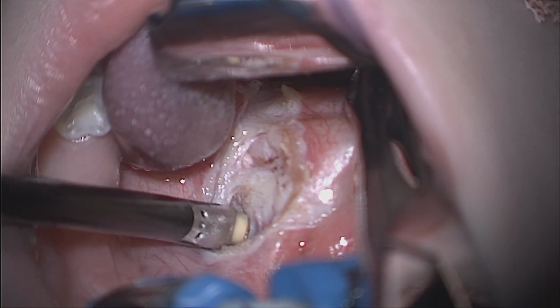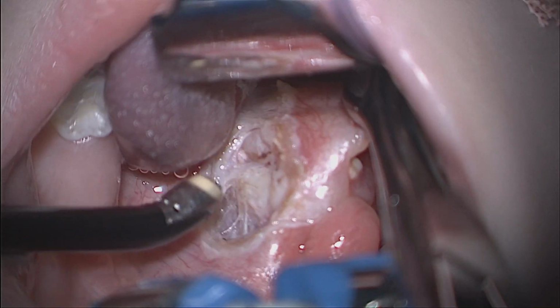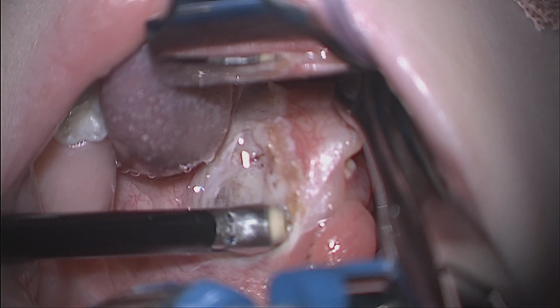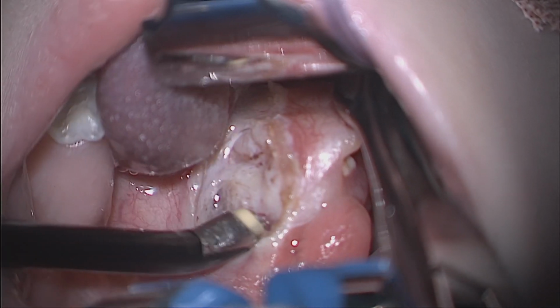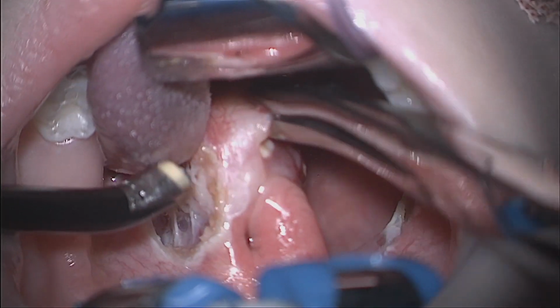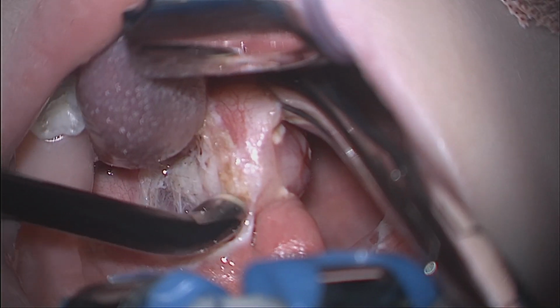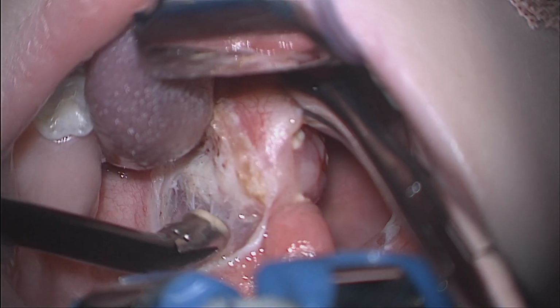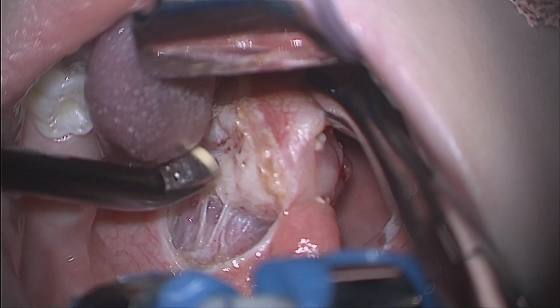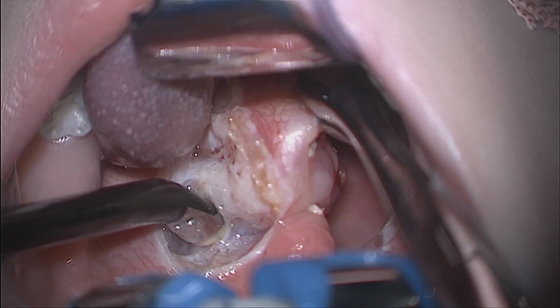Although the extracapsular approach carries a slightly higher risk of secondary hemorrhage and can be associated with slightly higher post-operative pain scores, in patients with recurrent tonsillitis, the risk of tonsillar regrowth with intracapsular approaches and the potential for further tonsillitis leads me to favour an extracapsular approach for this cohort of patients. In addition, the extracapsular approach can be performed more quickly and be associated with very minimal intraoperative blood loss, and is less painful than dissection with conventional bipolar diathermy.